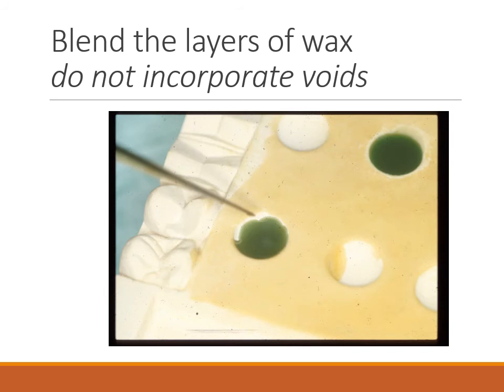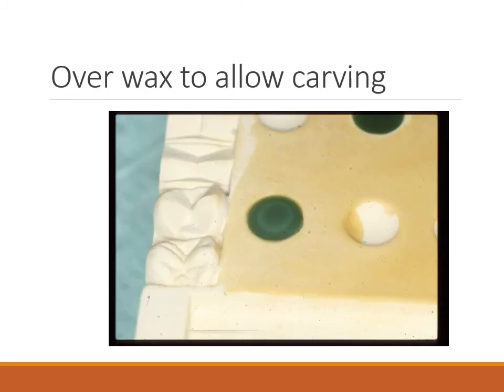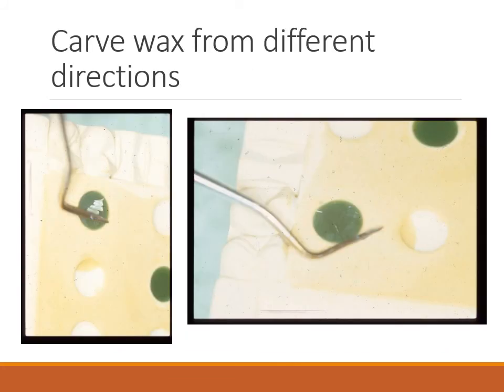Make sure you blend the layers of wax together with the heat and do not incorporate voids. If you are adding cold wax to hot wax or warm wax to hot wax, your layers will not blend properly. You can overwax the wells just a little bit so that you can carve it back. However, even on these steps, you do not want to go over the edges if you can help it. After you've overfilled your well slightly, you can start to carve it back from all different directions. And you can do this by rotating the wax carving block as you are carving.